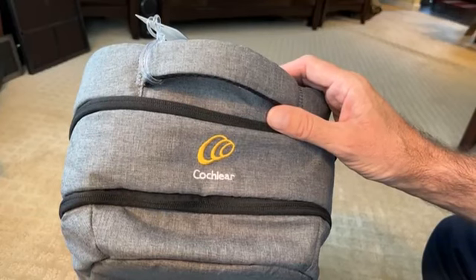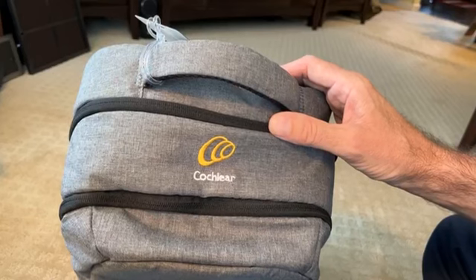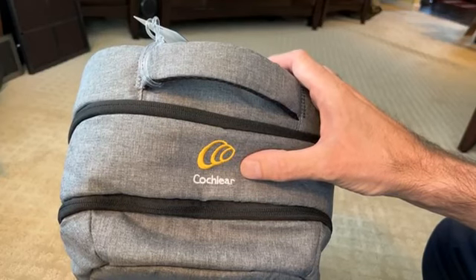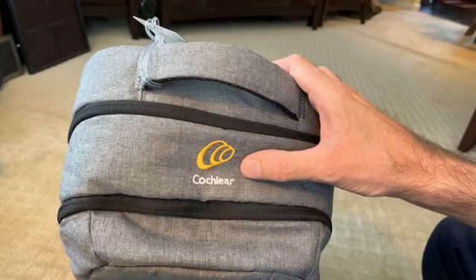I specifically picked the Cochlear brand. They gave me a choice among three brands, but the Cochlear brand had 22 sensors, more than the others. And I want to try and get as many as I can in my ear.